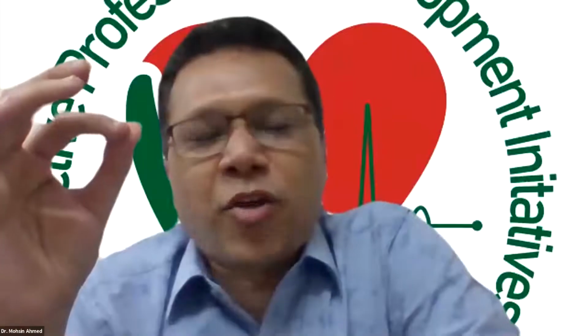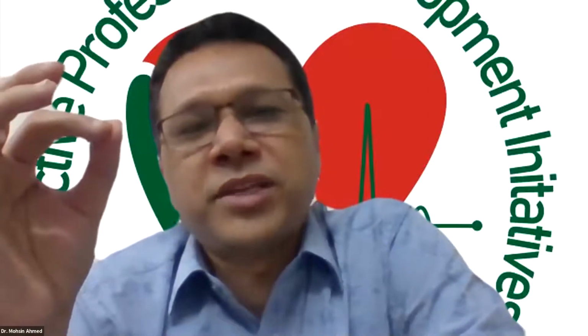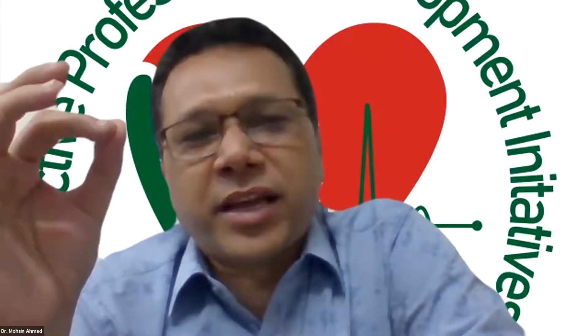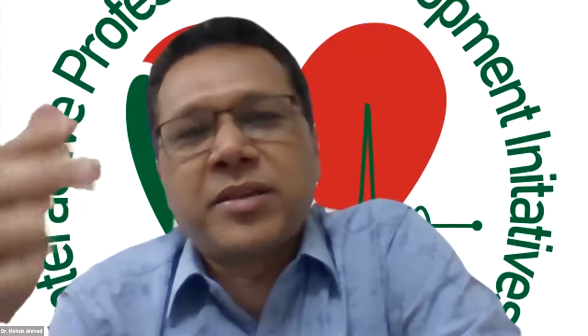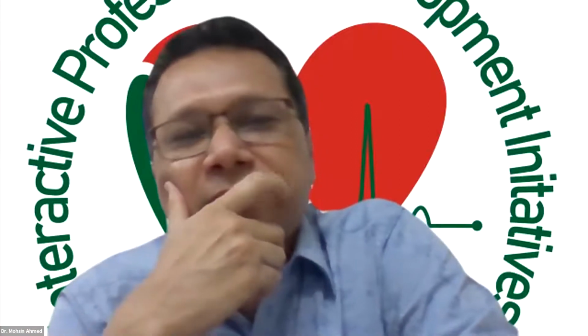For the fellows, choosing of the wire is not only about crossing the lesion, but also about seeing the plaque's morphology, which is most important for an antegrade lesion, not retrograde. Your comments, Kaisar, on choosing the wire in this plaque.